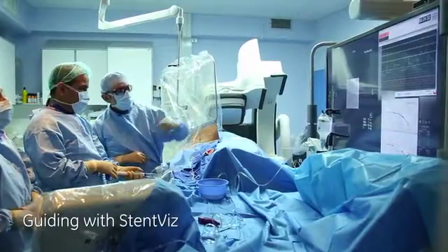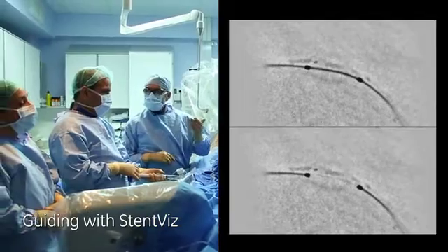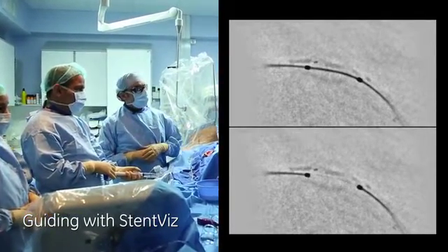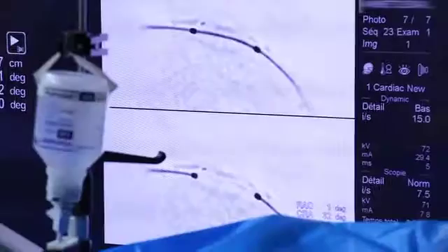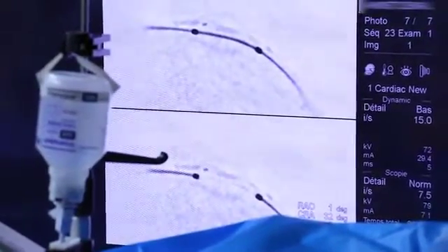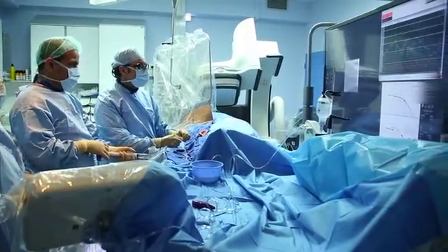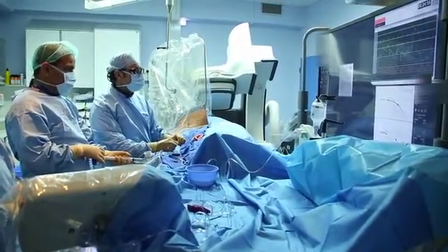As you can see here, we are too proximal with the balloon. So if I do an angioplasty of this area, it will increase the risk of a stenosis because of a geographic miss. So let's do it again with the balloon more distal.